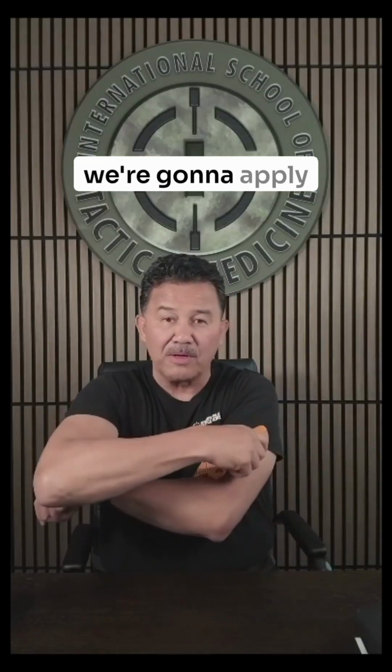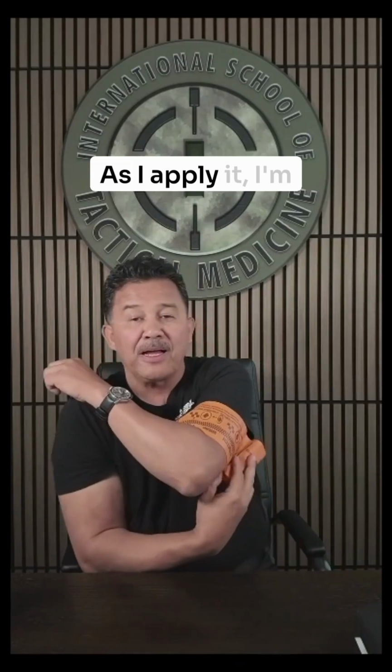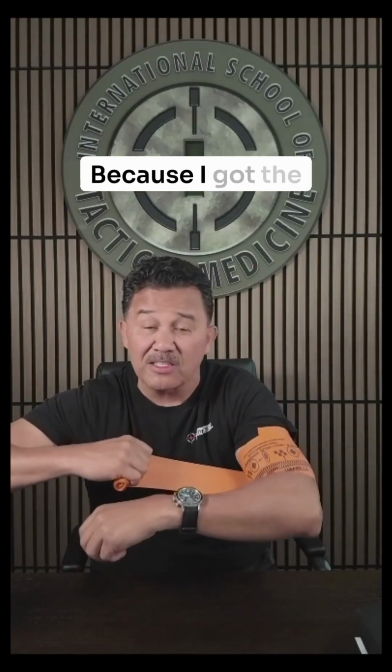Okay, let's go ahead and do this with a self-application of this tourniquet. Again, remember we're going to apply the tourniquet with the leader closest to myself. As I apply it, I'm going to make sure that I hold on to the roll of the tourniquet. I'm going to put pressure and make sure that I hang on to it so that I can get that first initial bite. And once I come over and under my arm, I'm going to again put the first pressure. Because I got the bite on it, it allows me to pull this much pressure onto it to get the first initial compression on this tourniquet.